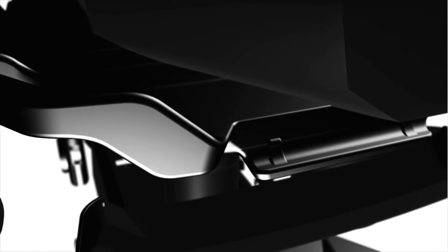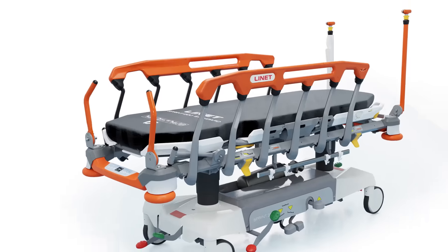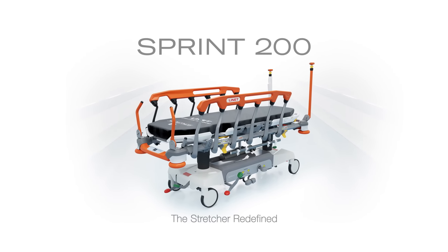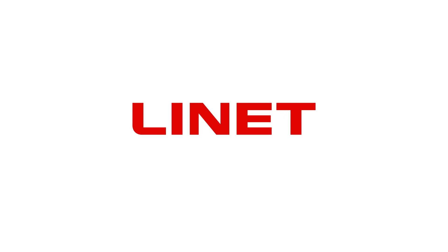This is how we imagine a new generation of stretchers. Sprint 200 by Linet — the stretcher redefined. Linet: designed to help you care.